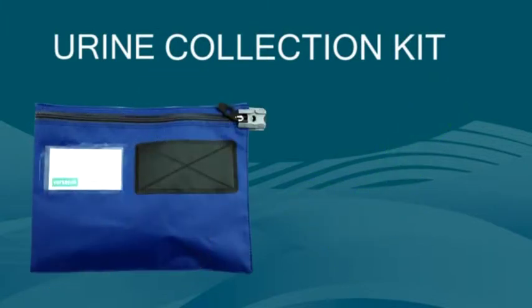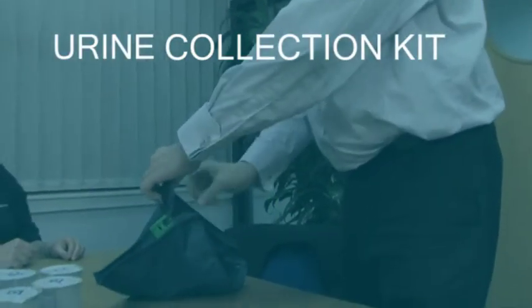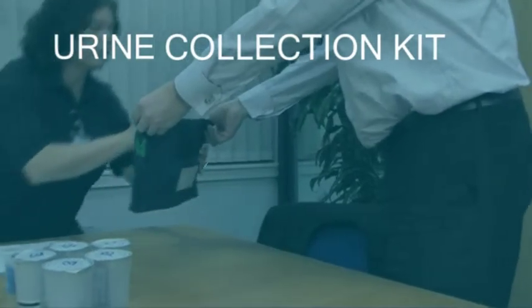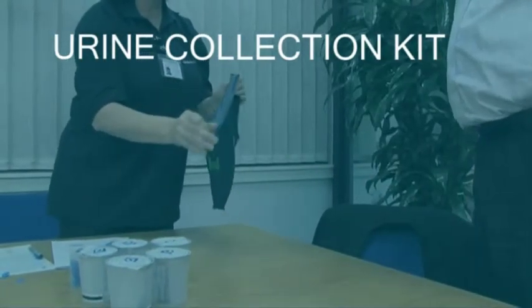You need a security bag, or a lockable drawer, for the contents of the donor's pockets. You will ask the donor to remove outer clothing, including casual headwear and heavy boots, to reduce the opportunity for them to substitute specimens or to try to adulterate the sample.